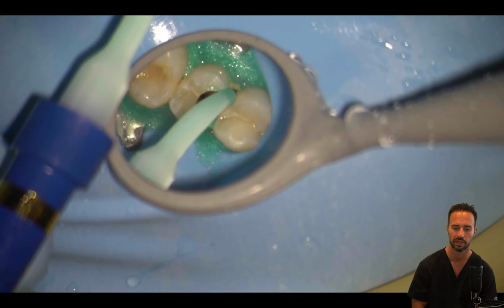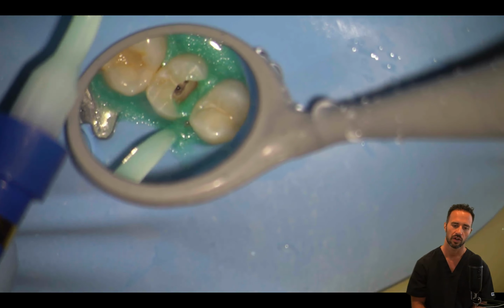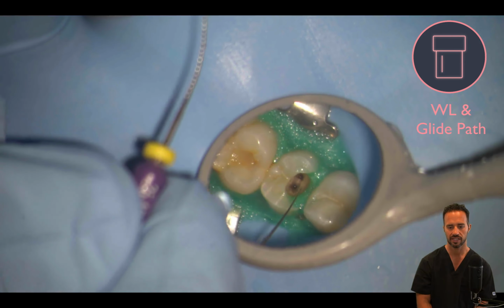We also don't want any bleeding to get into the area, right? So we want it to be airtight. So we're applying that circumferentially, and then we're going to go ahead and light cure that for 20 seconds. And so we got a nice clean field there.